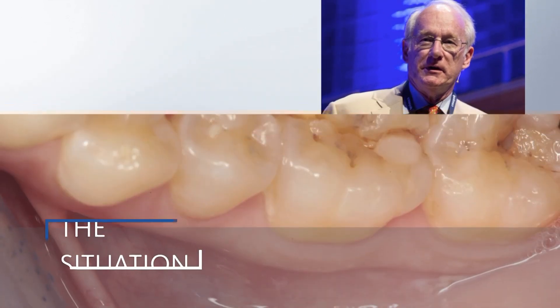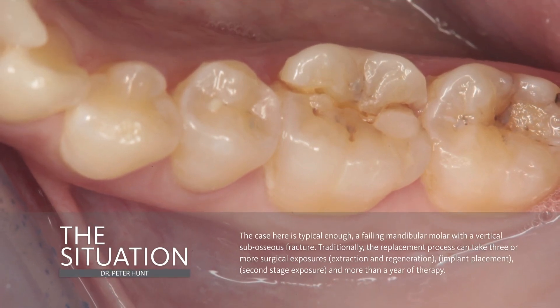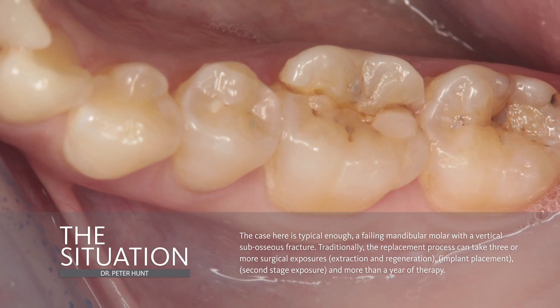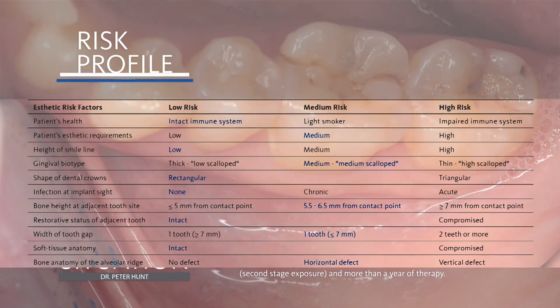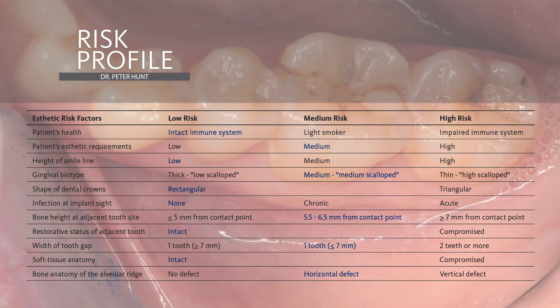We have a patient who has fractured a mandibular molar. It's a clean fracture. And the question comes about whether we replace this by a traditional mode or we can go faster at it. We're going to choose to go the faster route. The risk profile for her is relatively straightforward. She's healthy. She's young. She's fit.